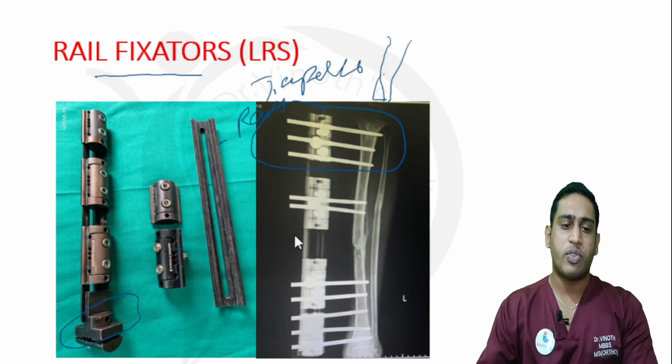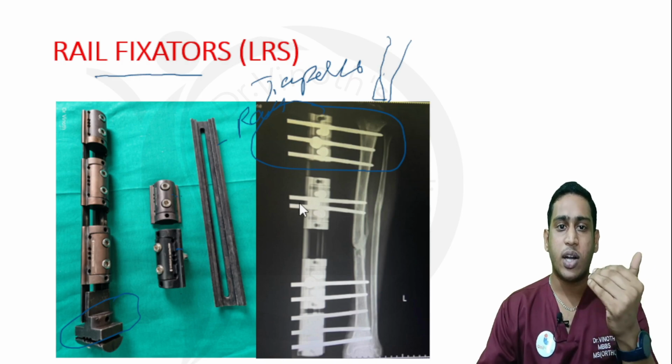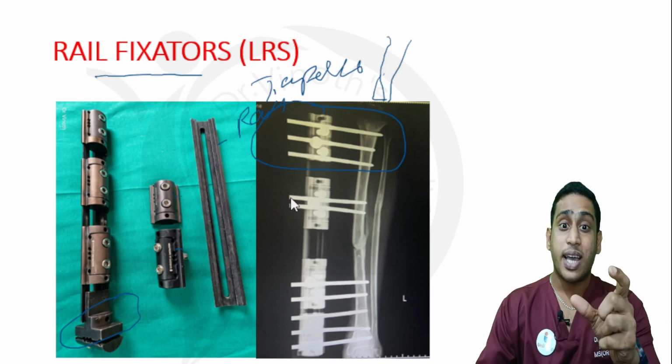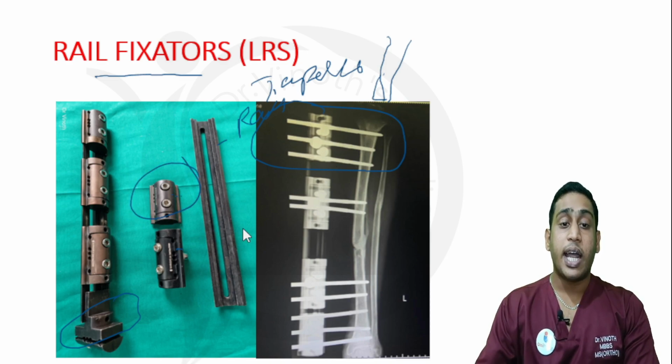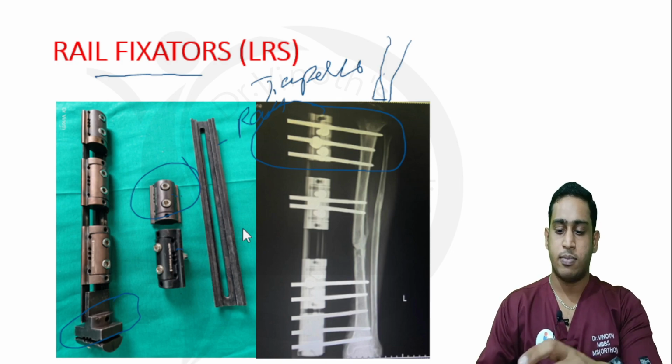So what is the use of the rail fixator? What is the advantage of a rail fixator in comparison with a normal external fixator? In the rail fixator, we can apply it as a definitive fixation because they can hold more tensile strength, or more stress, than a normal external fixator, because they have a tapering and thick SCHANZ pin. And one more thing, due to the mobile clamp, they can also be used for the limb reconstruction or limb lengthening process, similar to Ilizarov fixators.